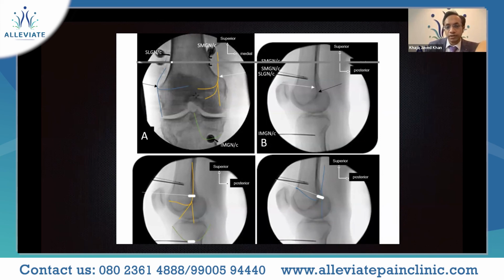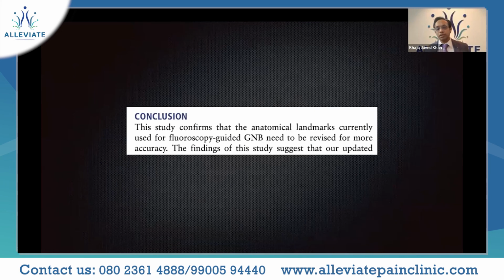You can see in the images that the needles are there, but the trajectory of the nerves is still quite far. So they concluded that the anatomical landmarks currently used for fluoroscopic guided genicular nerve block needed to be revised for more accuracy.